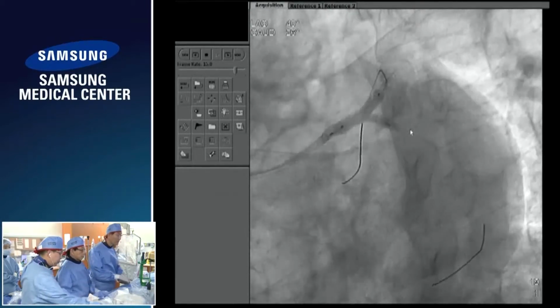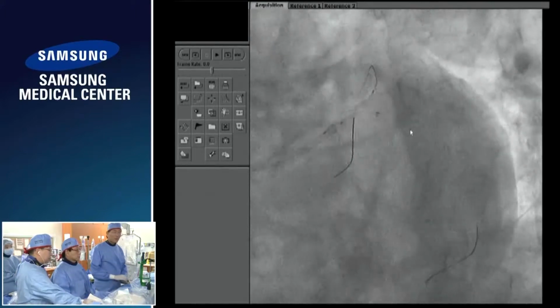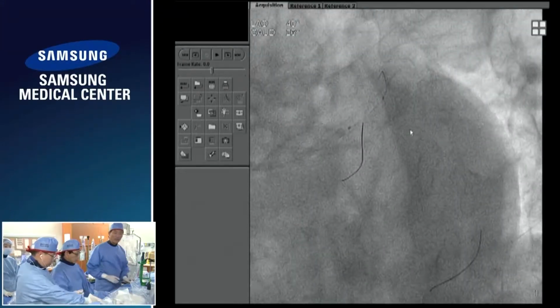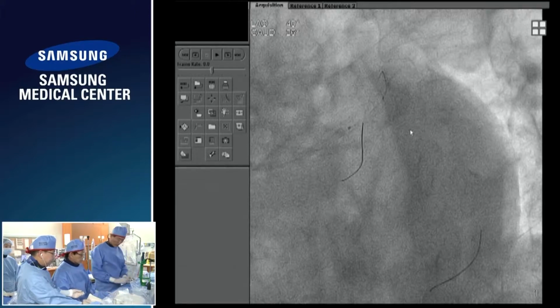Okay, great. So actually, I need anyway the 5.0 short balloon for a POT technique for left main anyway. But for POT, I have to remove all the balloons. But for this technique, very simple, very easy to proceed.